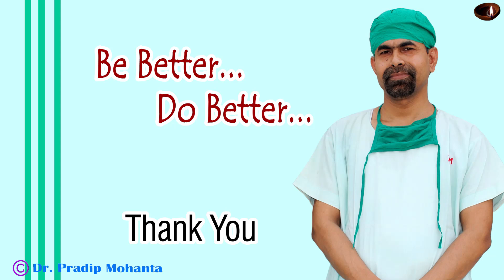Thank you very much for your attention. I hope this video will help you in developing your surgical skills. Learn submarine chop for hard cataracts. Don't wish it were easier — wish you were better.